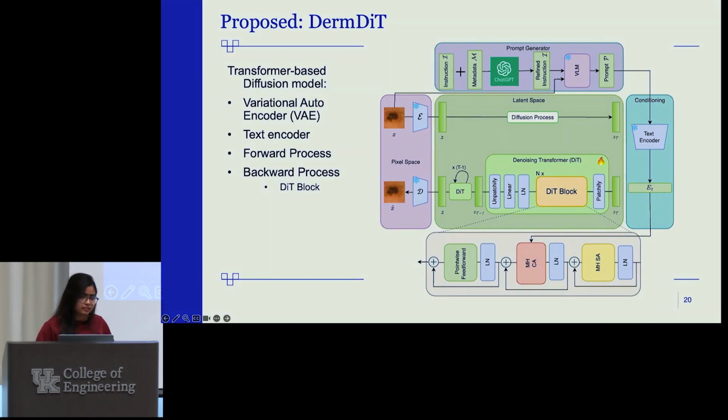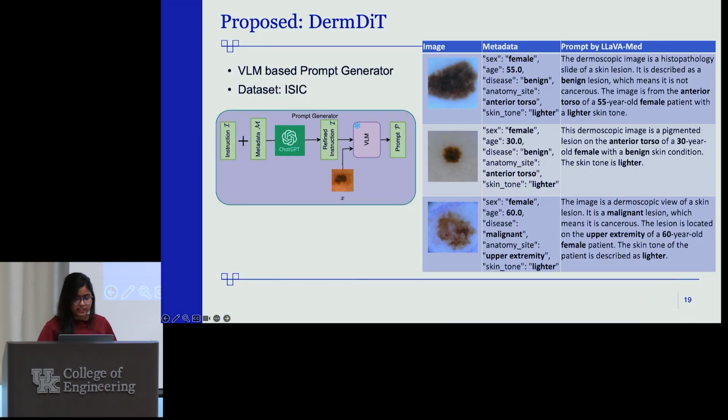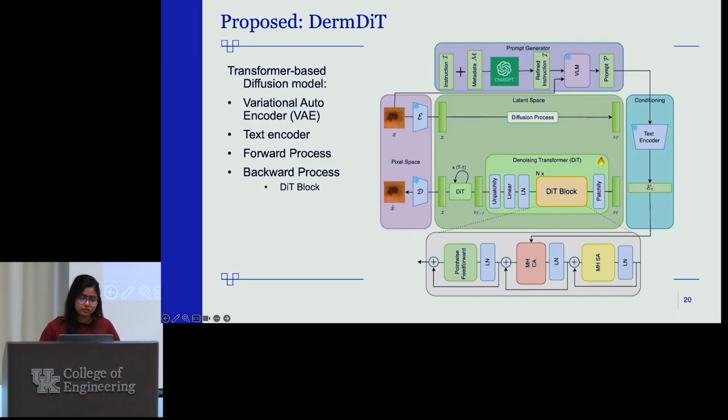When you compare two images, which weight is more important? The difference in the pattern or the difference in the pixel values? Depending on the attributes, each image has its corresponding attributes here. Based on these attributes, these images can be benign or malignant, or skin tone could be lighter or darker. Or put it this way: when you train this model, you have many data sets, right?